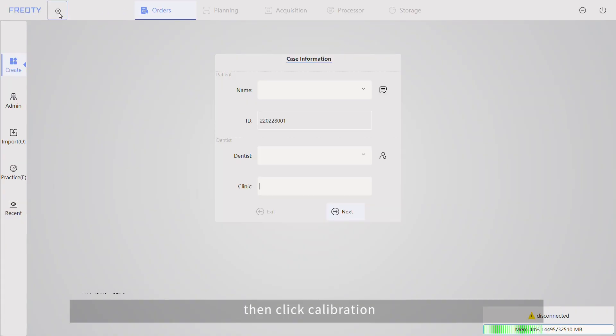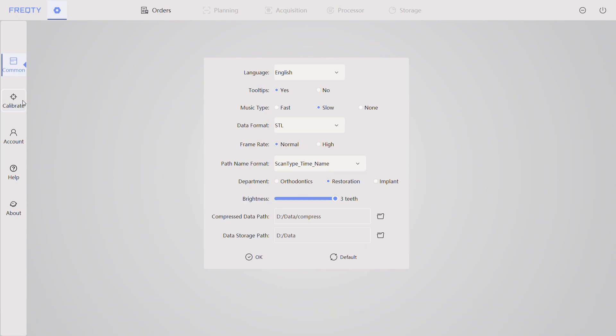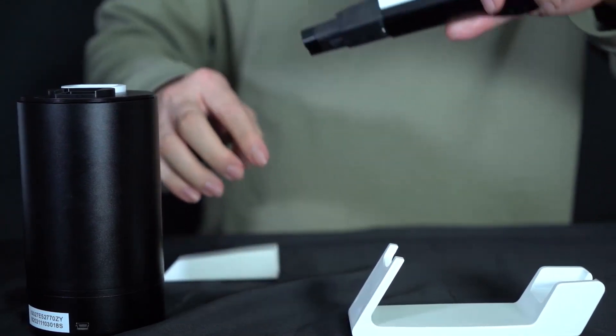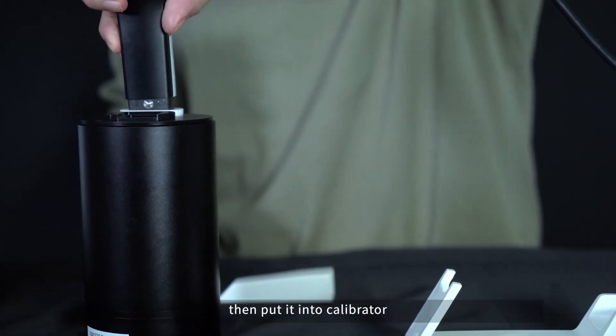Click setting, then click calibration. Pick up the scanner and take off the tape, then put it into Calibrator.